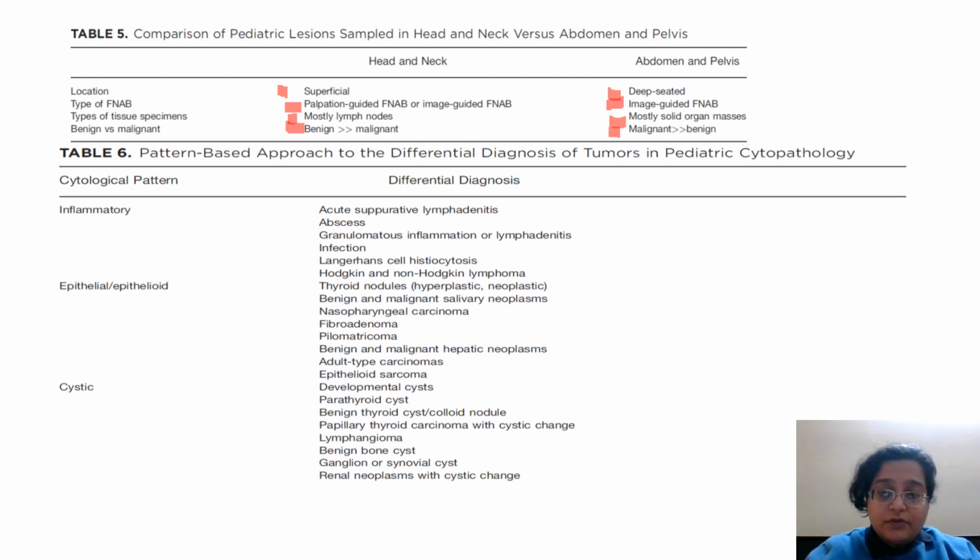Are you getting eosinophils? Are you getting some membrane fragment, which is common, whatever I'm saying I've already taken before. That is why I'm not showing the images right now. Which could be a parasitic fragment, or is it TB caseous necrosis or cold abscess, where you look for scattered epithelioid cells, degenerated cells, or maybe a granuloma.